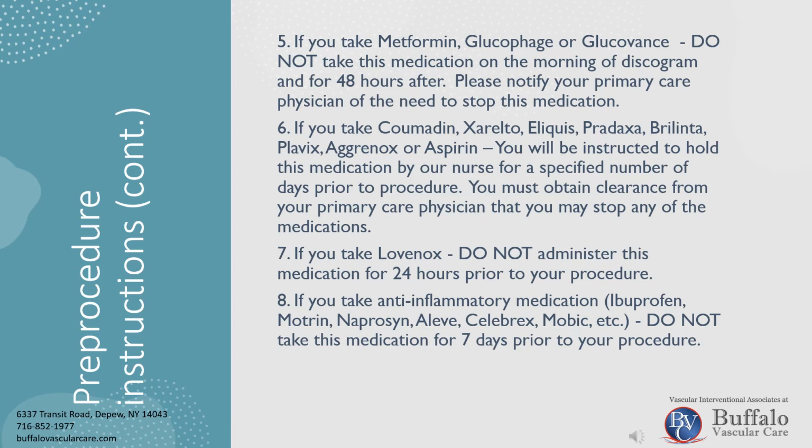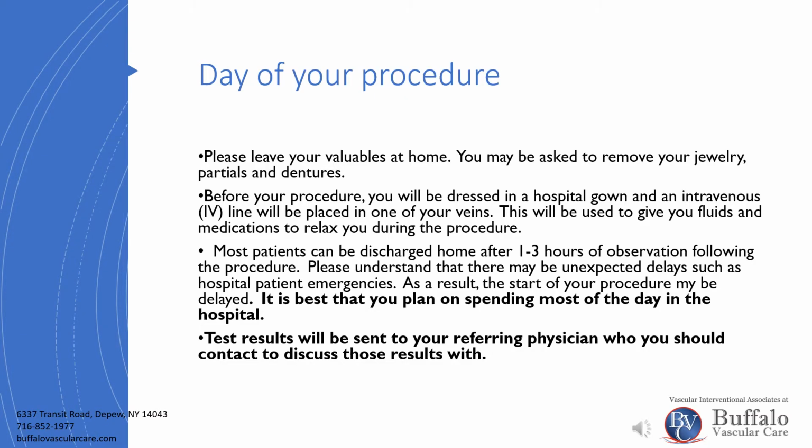If you take anti-inflammatory medications such as ibuprofen, Motrin, Naproxen, Aleve, Celebrex, or Mobic, do not take this medication for 7 days prior to your procedure. Please leave your valuables at home. You may be asked to remove your jewelry, partials, and dentures.